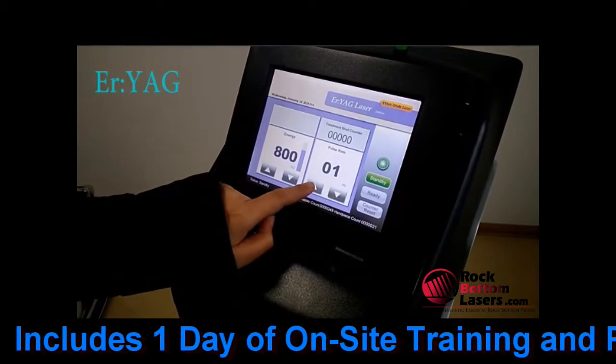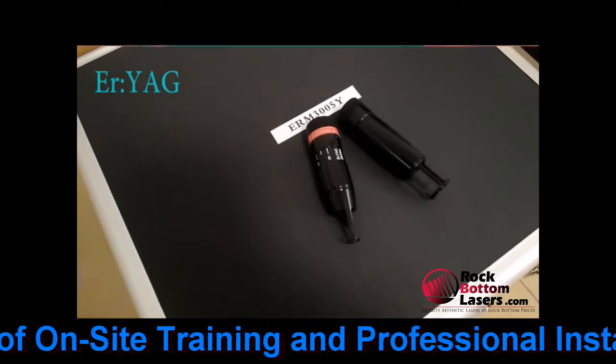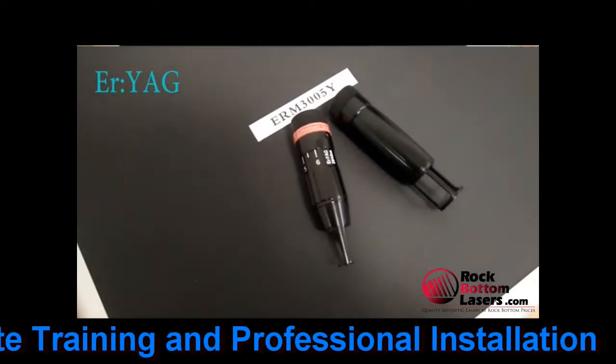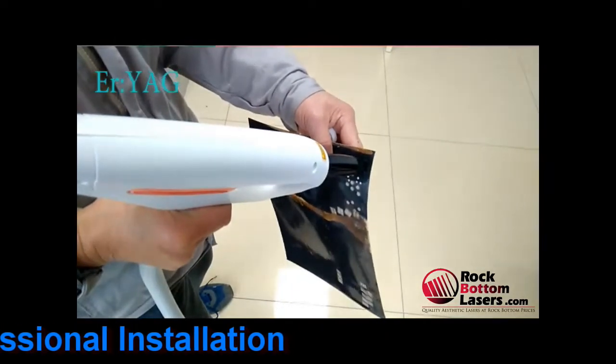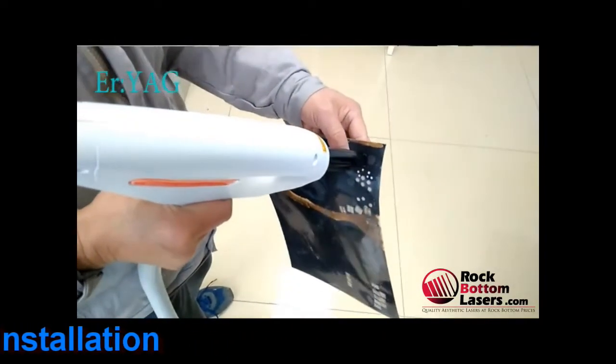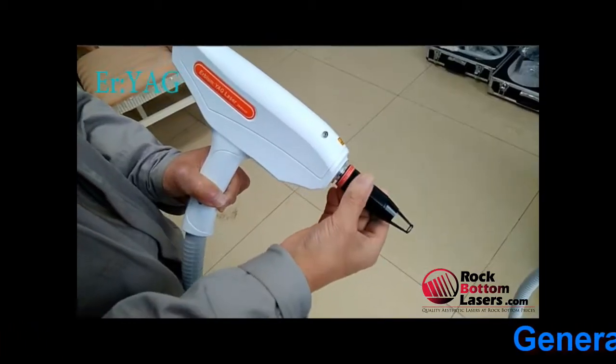It also has the 2940 for erbium laser skin resurfacing. It has the IPL with four filters that allows you to treat vascular and pigment and acne and hair removal, so that's also really nice to be able to provide that.